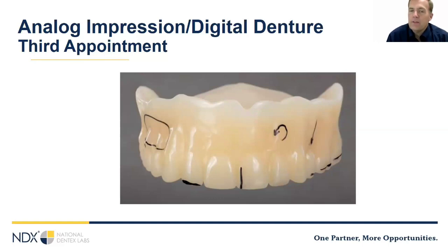So when you try this in, it really changes the nature of your try-in appointment. Firstly, it's sturdy enough for the patient to wear. So if you want, you can tell them, hey, this is a prototype. Why don't you take it home, use it for a day or two, let me know what you think. You can also mark on it, grind on it, reline inside of it. So it's very sturdy.